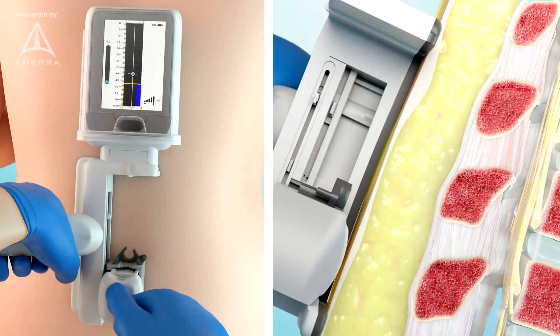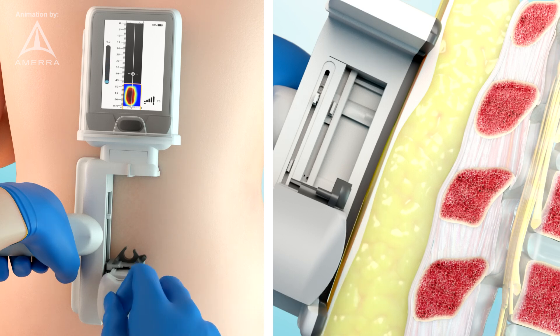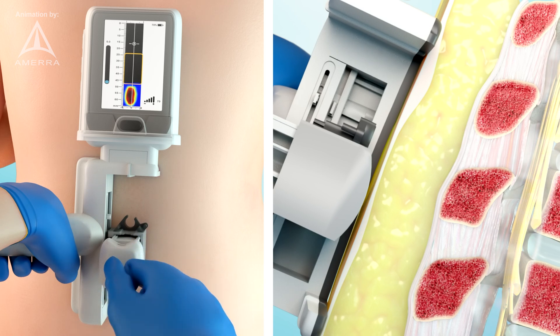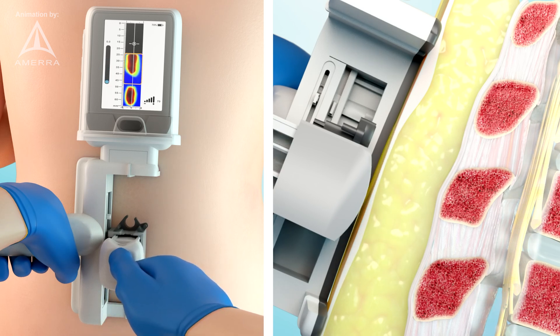Begin generating the image by pressing the applicator into the tissue at a first location along the imaging track. Slide the applicator to a second location and press it into the tissue. Repeat this process until a complete image is generated.